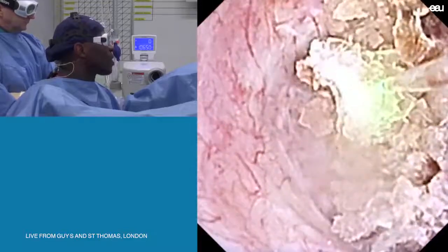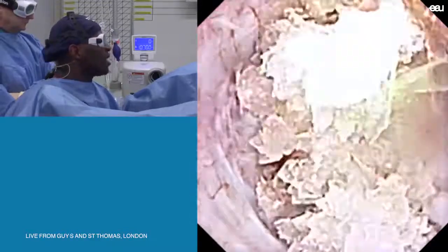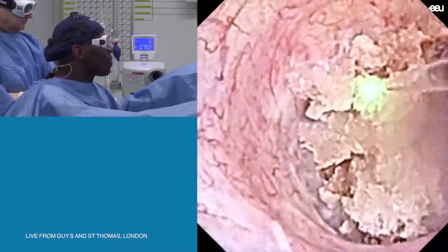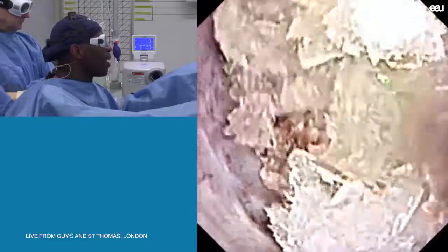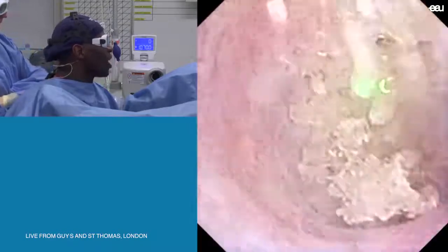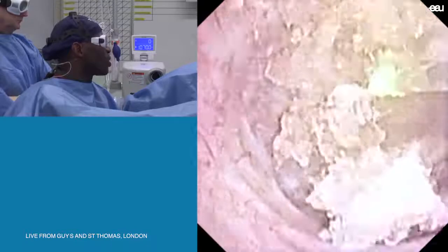What kind of basket do you like to use? Well, in a kidney in this sort of position, I'll use an N-gauge. This is the one thing with the digital flexible FlexXC — if you're not used to using this, or you have one of the non-digital scopes, the view can be quite deceptive. So you need to be using a digital scope constantly so your eye really recognizes when to stop and when to proceed.